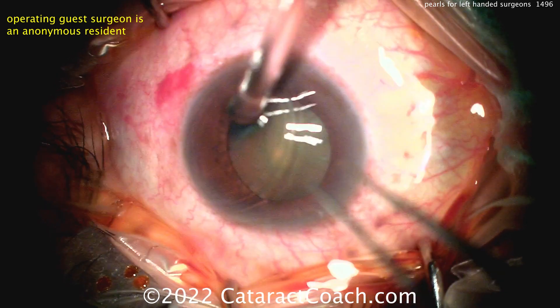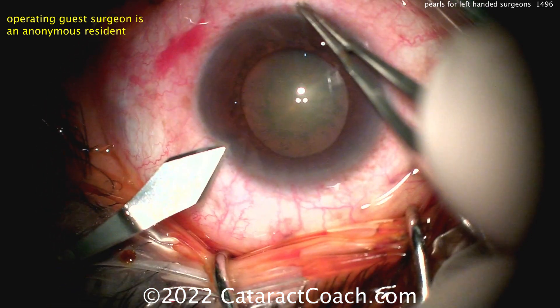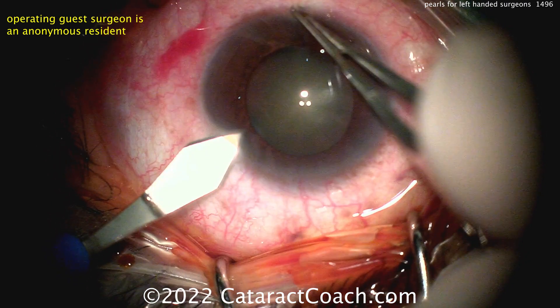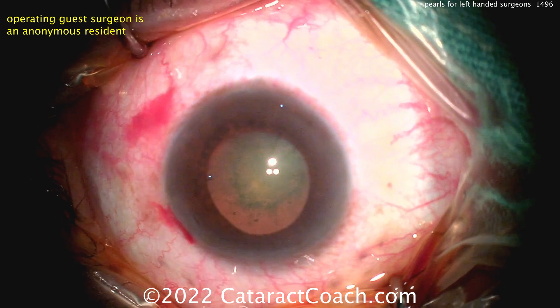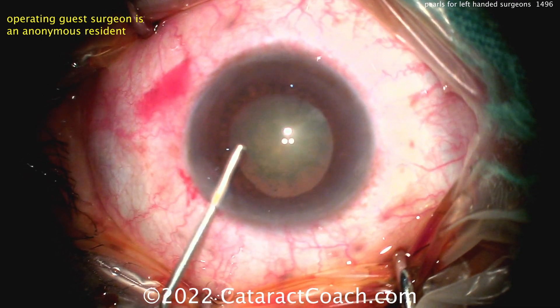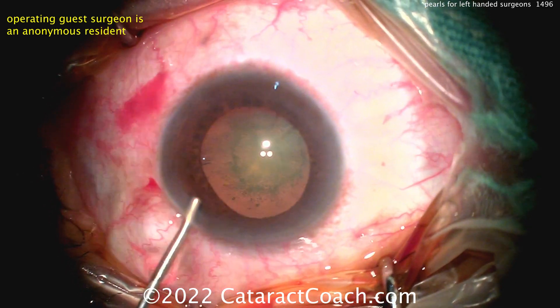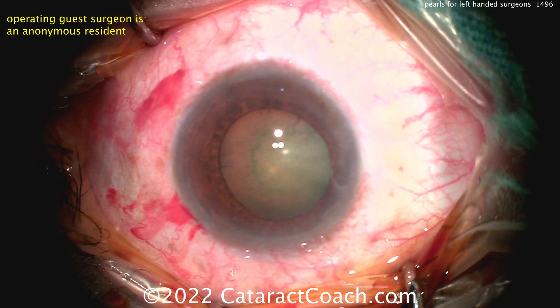Here's the eye at the beginning of the case. We're going to show you a video of a left-handed surgeon, holding the keratome in the left hand, sitting superior, making that incision — a little short on the tunnel length for my preference. The patient obviously has a real cataract, with some nuclear component and significant PSC, or posterior subcapsular. Putting in the viscoelastic — it looks like HPMC — coating the cornea as well.